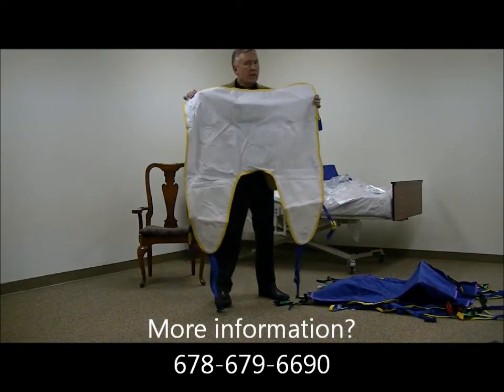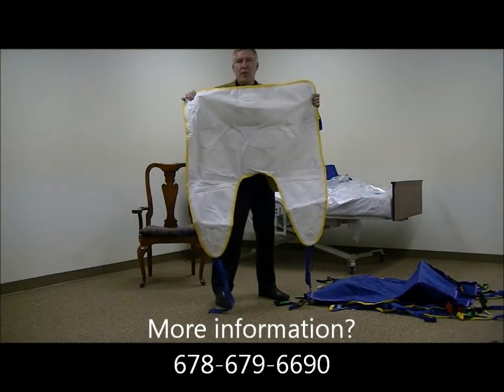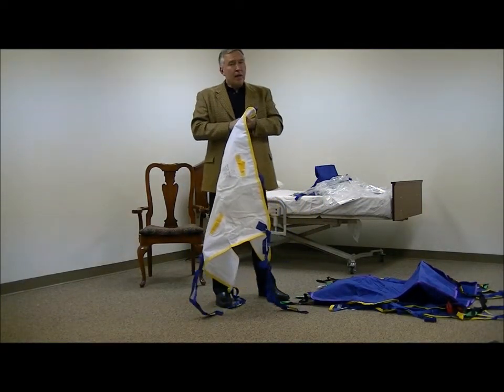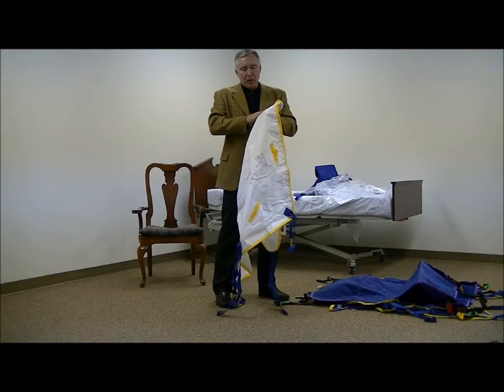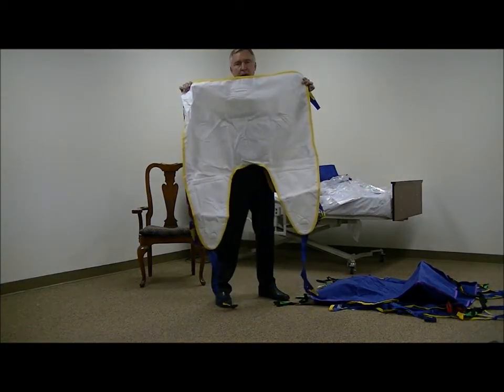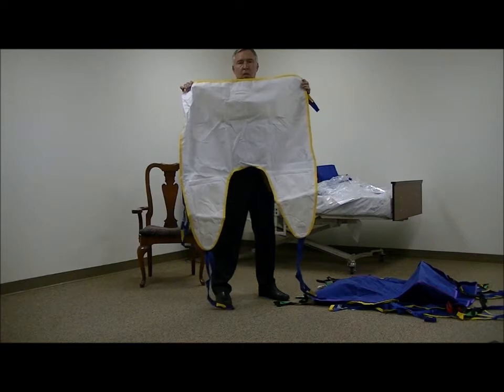So these slings are not that expensive, and most people would prefer to have their own. They can be spot washed. They can't be laundered. They can't be put in the laundry for washing, but they can be cleaned. And many times these can last months before they get to the point where they need to be replaced.